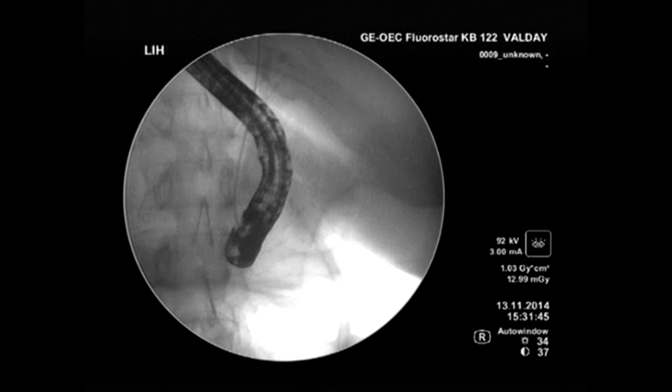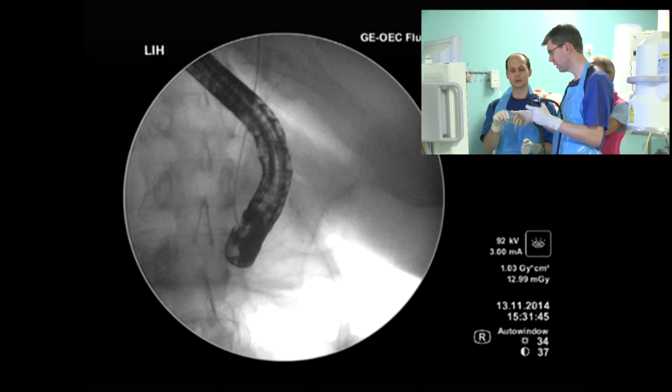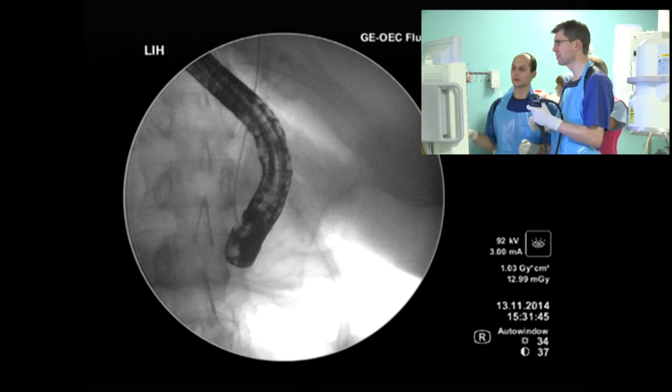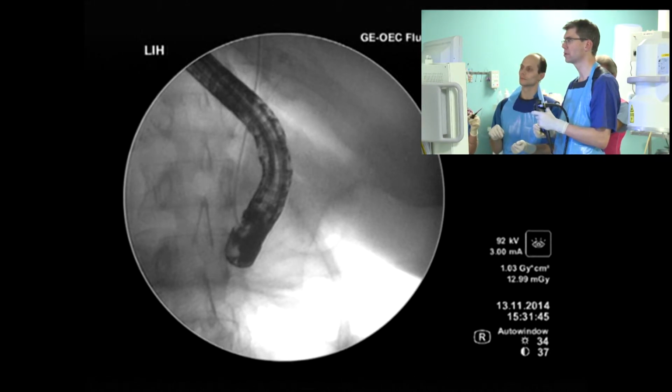I didn't have too much of a feeling of pressure on it, so I'm not very sure about the biopsy, but we'll see. Yes, Alex, but one question. Why do you perform biopsy from this part of the CBD? Why don't you perform biopsy from the hilum in this case? We are doing this one after the other, so we need a number of different small pathology pots. This is the distal third of the CBD. And I'll try to take at least 3 biopsies here, and then we'll advance slowly into the proximal portion.